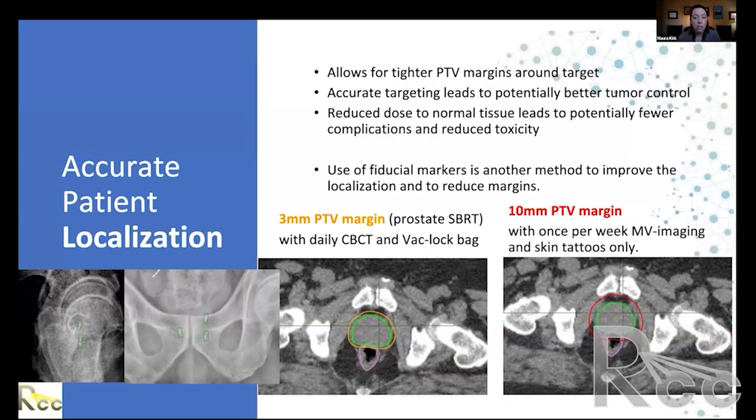beam images. You can use those contours to identify where you want to shift the patient. So you want their markers on the treatment day to fall within the contours from your original planning CT to know that your prostate is in the same position as it was for treatment planning.